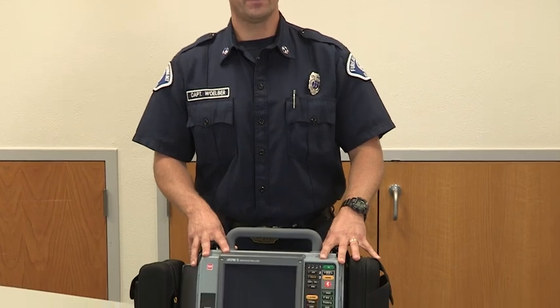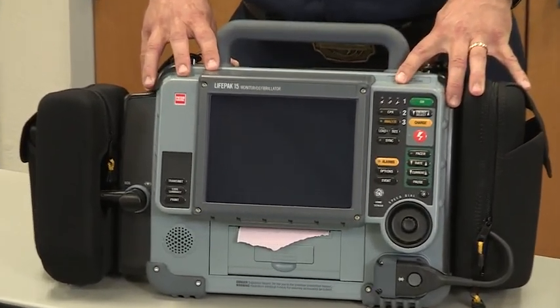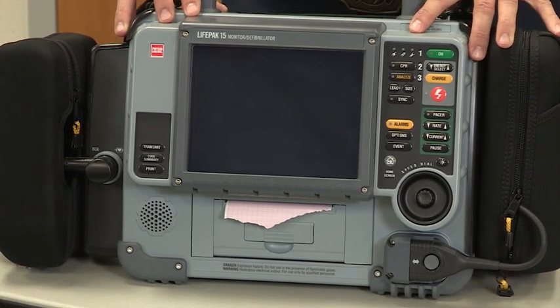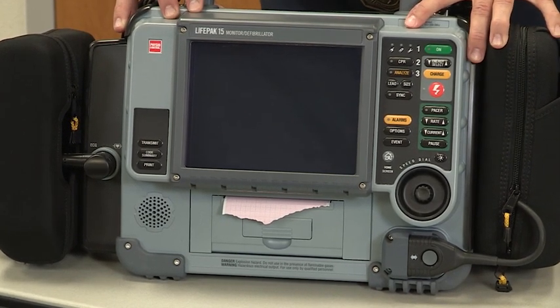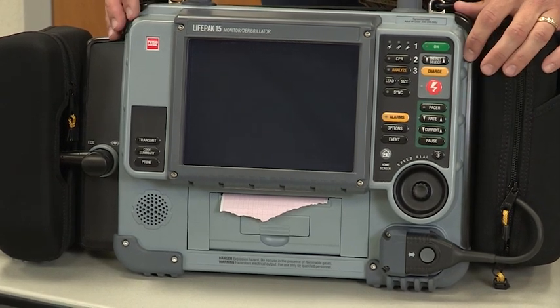The important thing to take away from this is to not use a bleach-based product when cleaning any parts of the LIFEPAK 15, cables, or the pack itself. What we recommend is an isopropyl alcohol-based or a peroxide-based cleaner, such as our disinfecting hand wipes, the new PDI Hygieia hand sanitizing wipes, Purell, or the Rely-On products. All are acceptable to wipe down the cables, the face of the unit and such.